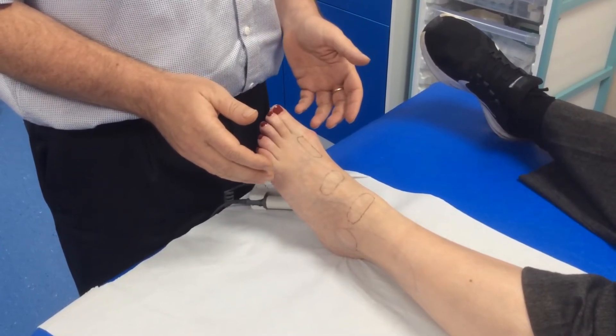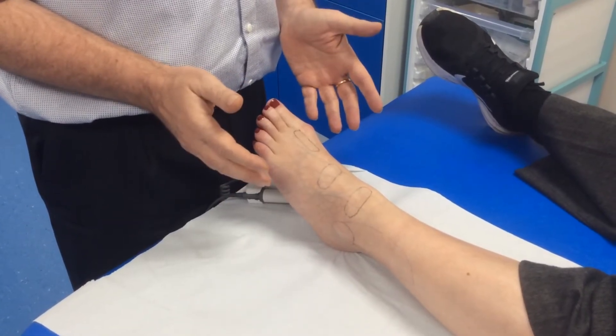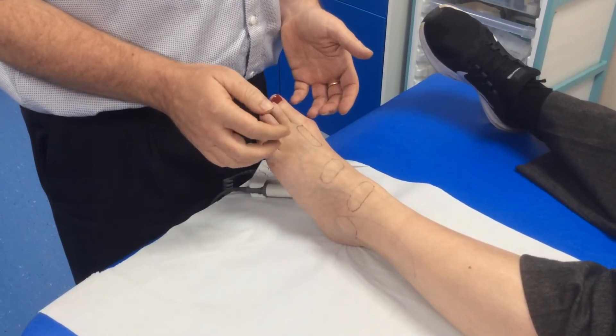Today I'm going to demonstrate how to locate the dorsalis pedis or anterior tibial pulse with a Doppler. First of all I would think about where I'm going to look for the pulse and I would usually search for it in one of these three areas with the Doppler.